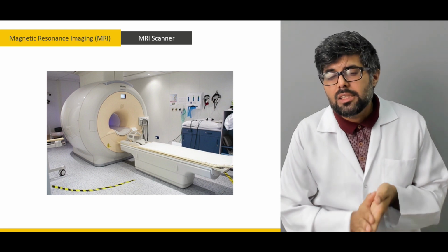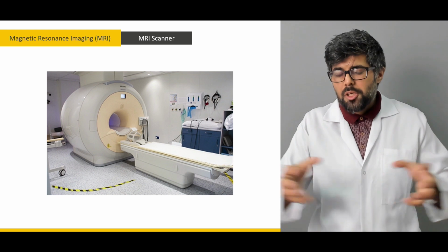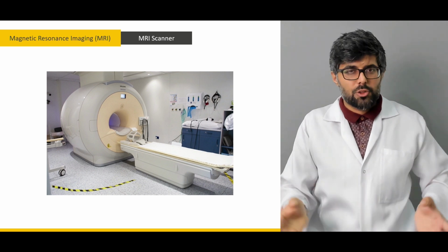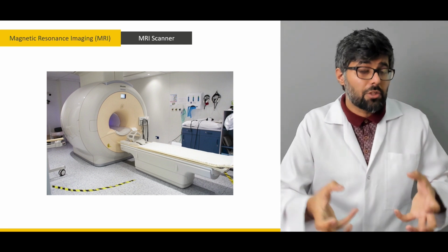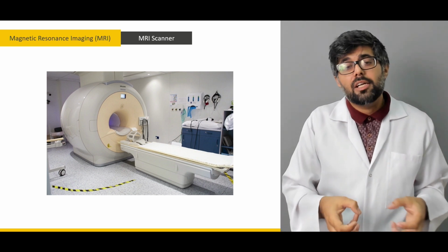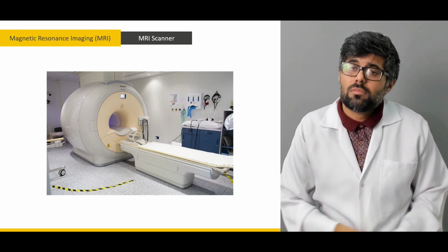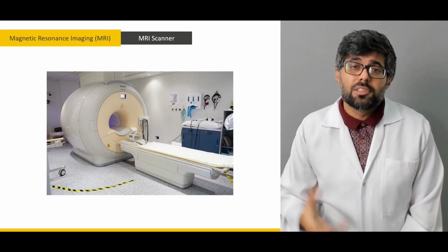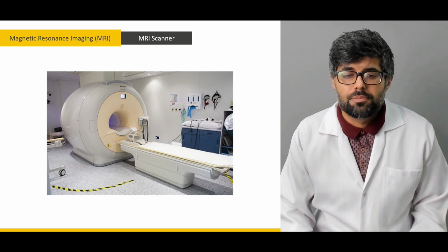Another thing is that apart from the main magnet, there are also multiple other magnets distributed along the cylindrical body, which produce the gradient, and that gradient produces the contrast or the finer details in the image that is produced.